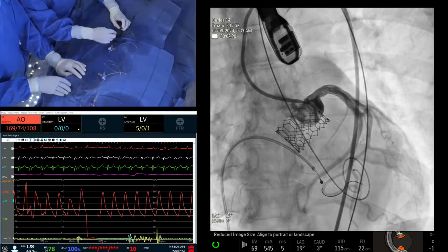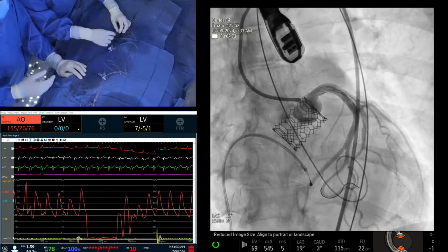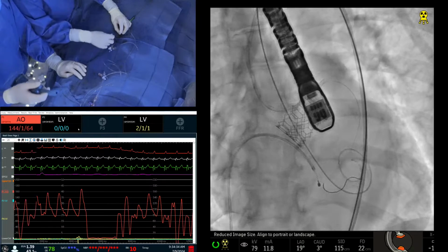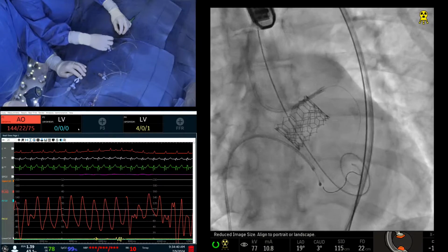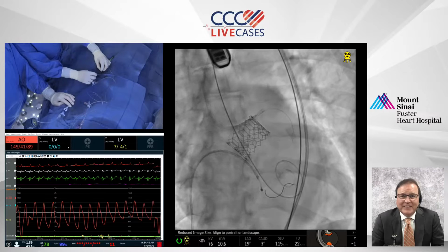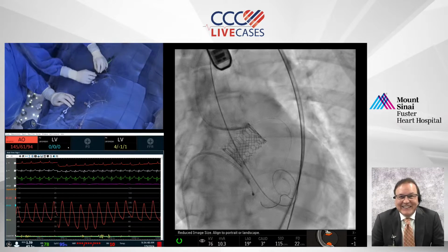And also we showed that you could pass the guide through the STJ easily. So that's reinforcing the thought that left main will not be that big an issue, but it could still make sense to protect. We can leave the guideliner or Godzilla there. That's another part. We don't need that. It will be easier to pull back. No, then your guide has to come out first. So what are you trying to do, AK?